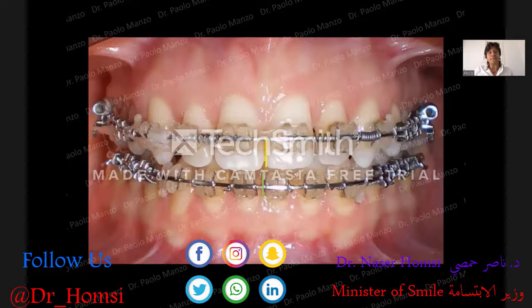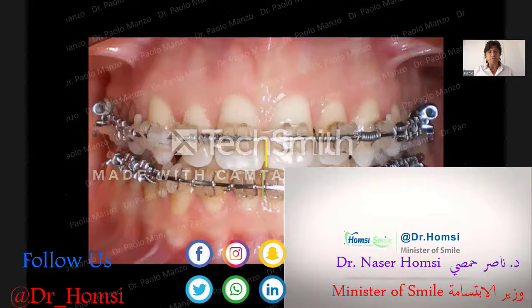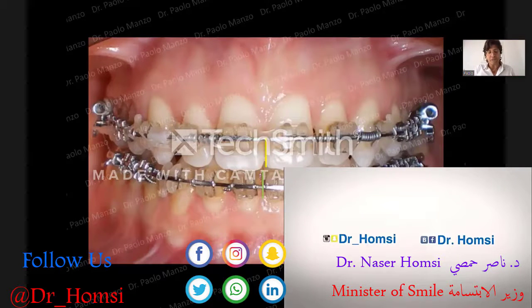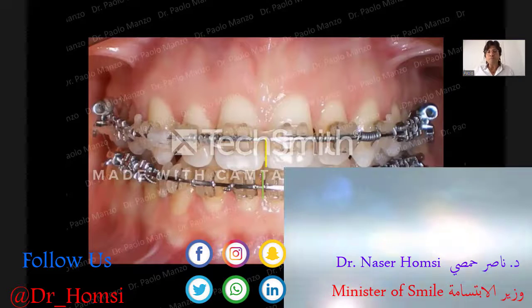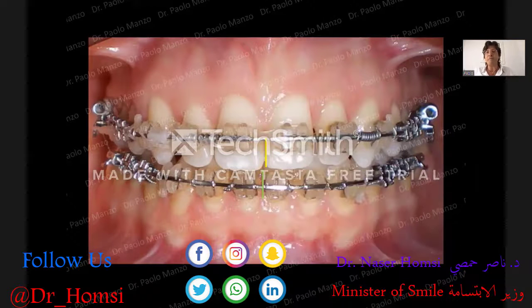I started the orthodontic treatment in this patient, and I want to show you how I managed the position of the teeth before the restoration. It's very important to manage correctly the position of these teeth, because sometimes these movements have to be very, very light, like 0.2, 0.5, 1 millimeter, no more usually. And so I want to show you what happens if I want to move this lateral incisor 1 millimeter toward the dental midline, so 1 millimeter in this direction, on the right side of the patient.